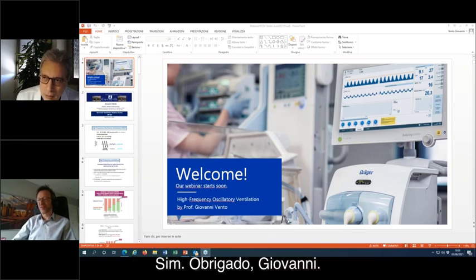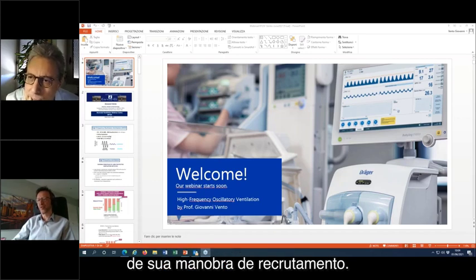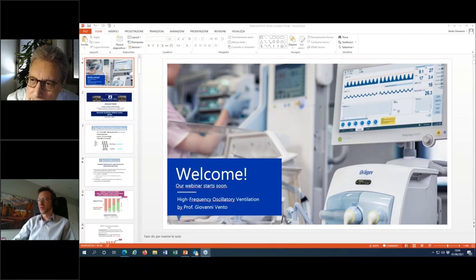Yeah, thank you, Gianni. There's another question which relates to phase 3 of your recruitment maneuver. In phase 3, do you go directly to the known mean airway pressure, or do you increase mean airway pressure slowly to the same value?